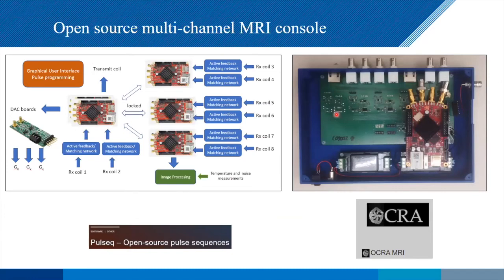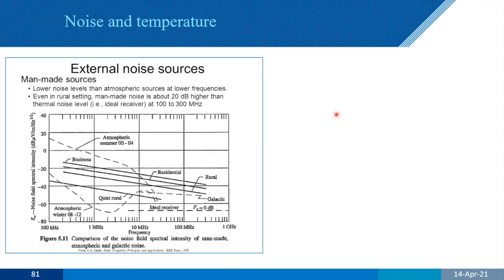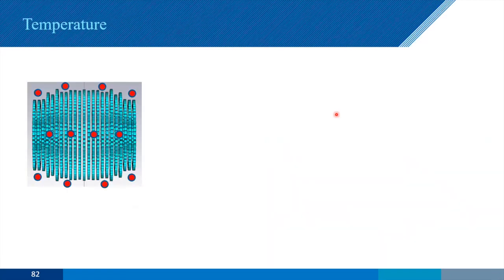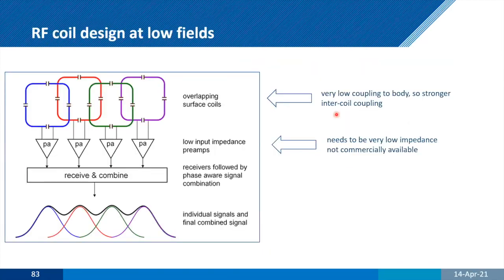Other things are working. Jason Stockman, of course, is one of the pioneers here with Thomas Witzel in terms of OCRA, and we're looking to try and integrate that into our setup. We also have to look at external noise sources. We have to look at changes in temperature. We know the temperature changes. At the moment, we assume it's linear, in other words, that it's homogeneous everywhere within the magnet. That probably isn't true. So we'll be looking at temperature sensors and then how to reconstruct those. One simple example is to put in 16 and then do a third order spherical harmonic distribution correction.